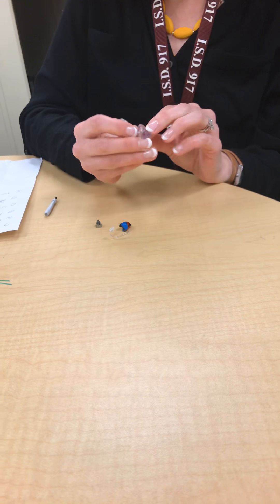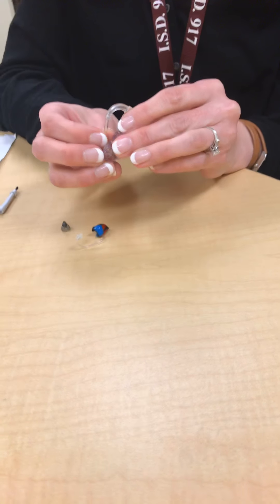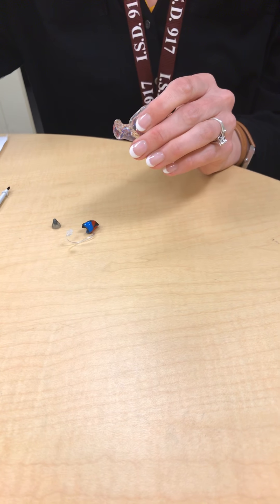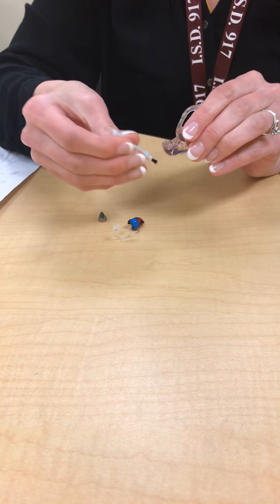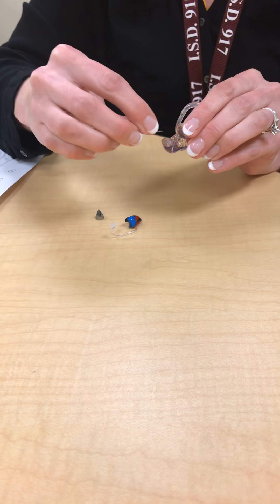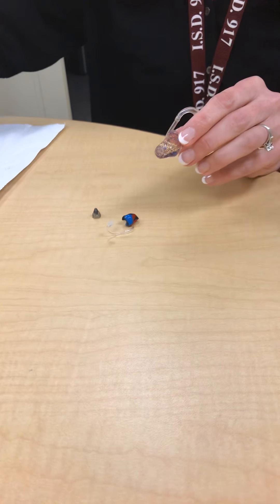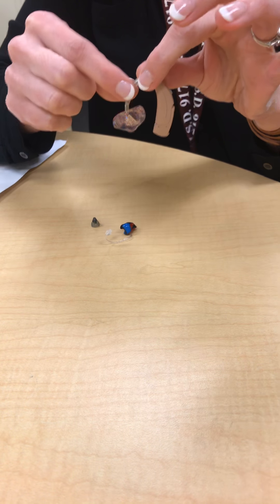If you have checked the battery and that's not the problem, the next thing you want to do is check the ear mold. Look in the ear mold to see if there's wax or debris in the opening that goes into the student's ear. There are a couple different ways you can clean an ear mold: you can use a wet wipe to simply wipe it, or you can use one of these wax tools. The brushed side will brush debris out and the picked side can be used to pick any wax or debris out.